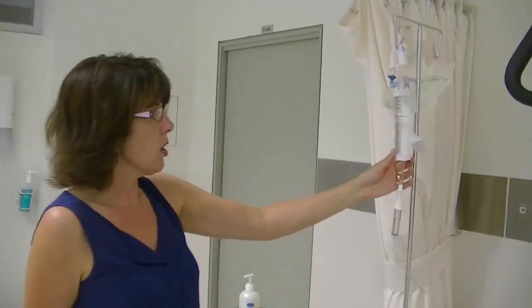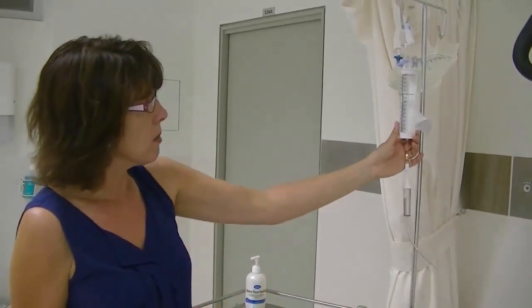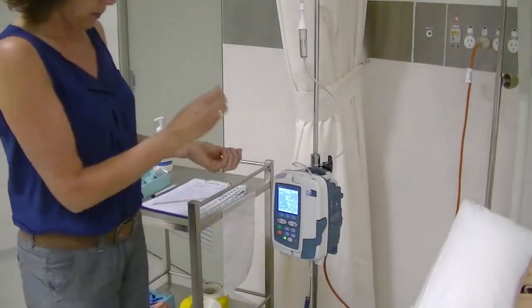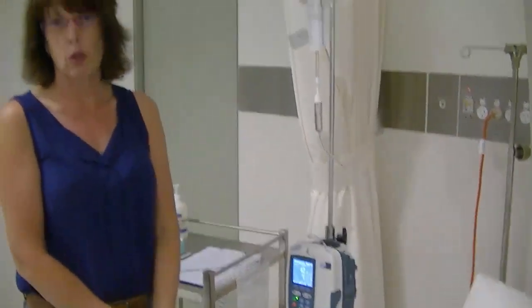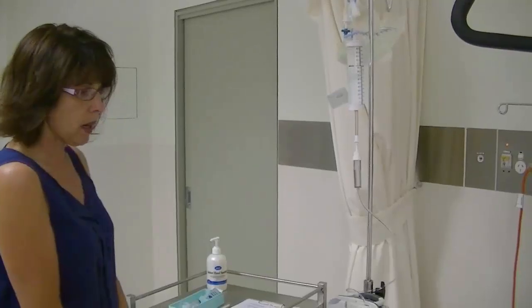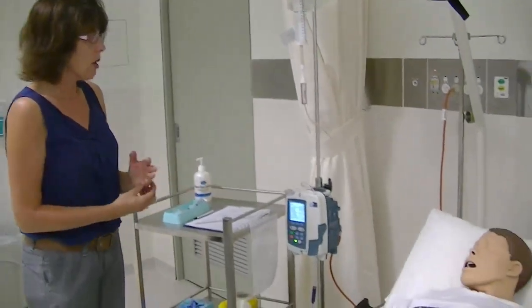So it said I had to give it over at least 30 minutes. I'm going to give it over an hour. So that's 80 mils over 1 hour, that's 80 mils per hour. So then I would say I need to change it to 80 mils per hour, and I would change the rate. Now, Jessica, if you have any unusual feelings whilst you're having this drug, please ring the bell.